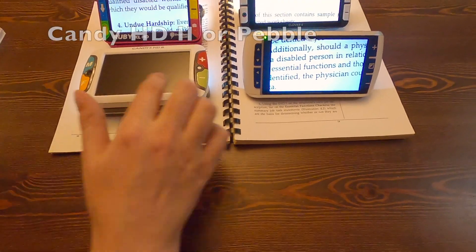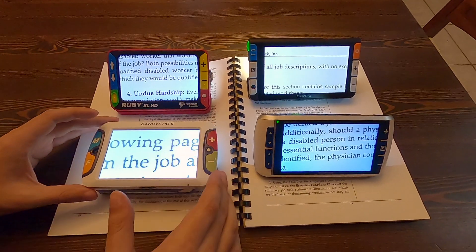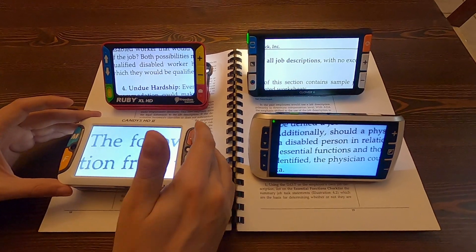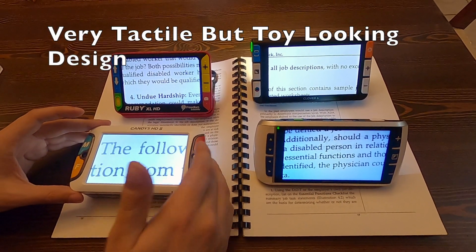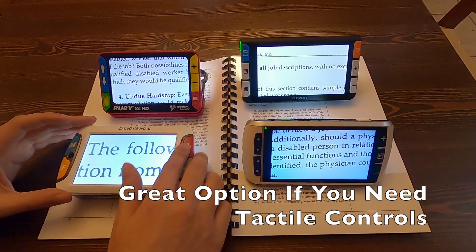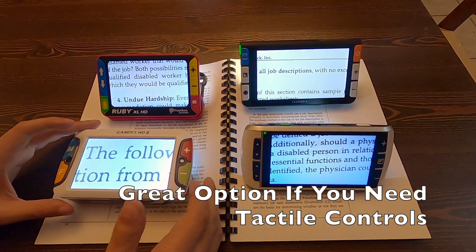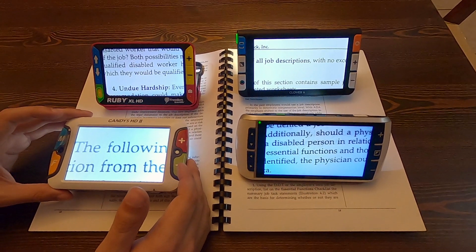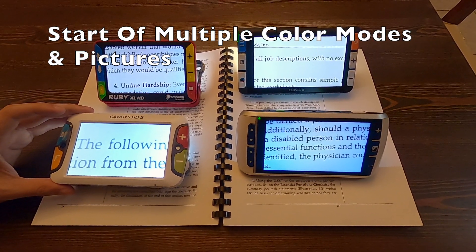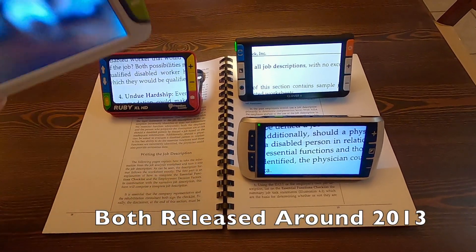Then you get into the Candy HD or the Pebble — I believe they were around the same time and they're very similar in the features they have. You've got kind of these big childish buttons, very tactile friendly for if your vision needs require you to use tactile over a touch screen. They have a few more color modes and they can take pictures where the Optolex couldn't, but they are very childish and cartoony.